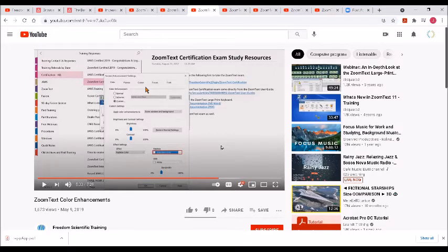One of these that I think is really nice is this last one about replacing color, because a lot of people will say that on web pages it's real popular to have sort of a grayish color text that's really hard for people to read if they have low vision. There's not enough contrast. And so you could ask it to replace that color with just a black color, and that would occur on any web page that you're on.